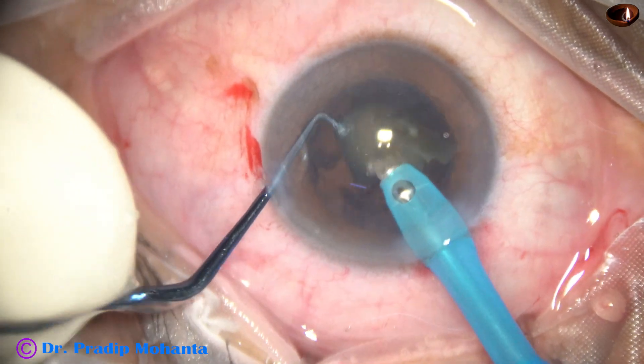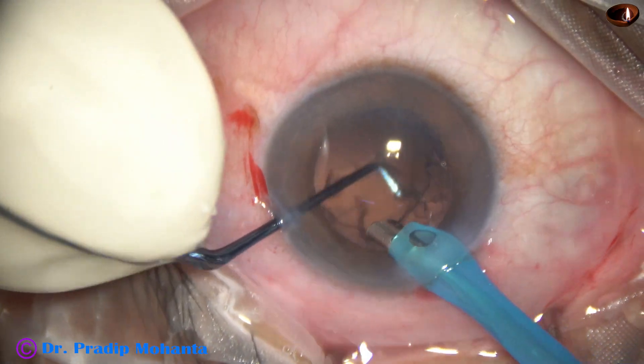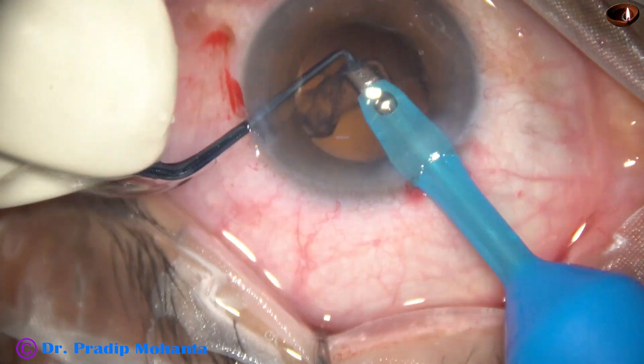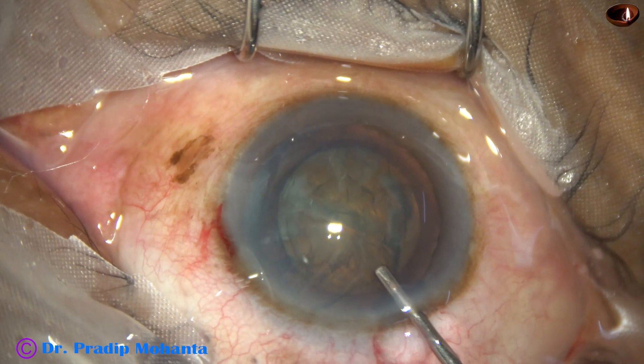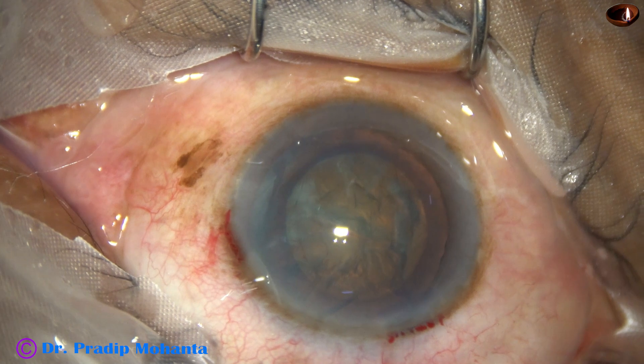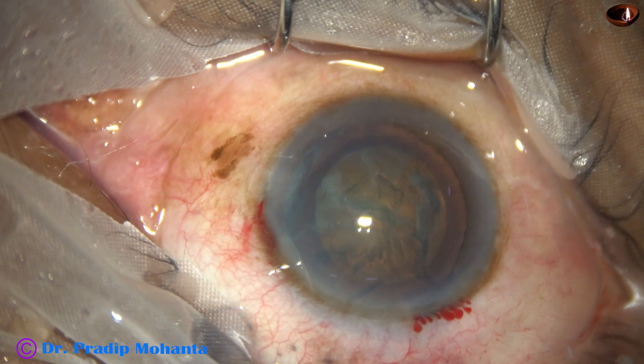The length of the sustainer is 1.7 mm and the length of the pre-chopper is 1.8 mm. Now let us see one video clip at 50 percent speed — half of the real speed.